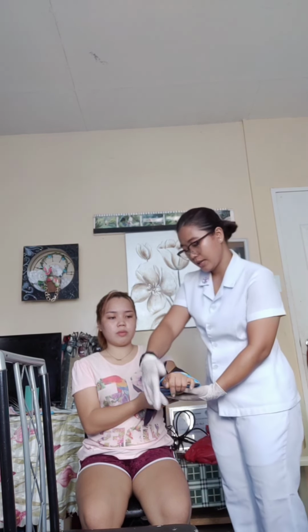After this, we will recheck the circulation of our patient, which is the warmth, the temperature, the color, and the pulse. Ma'am, pwede pakilihok sa imong fingers, ma'am. Okay, the color is pinkish. Ma'am, check na ko imong pulse, ma'am, ha? Okay, the pulse is good. The patient can still feel her arm and move her fingers. It is warm and has a good color with pinkish nails and a good pulse, which signifies unimpeded circulation.